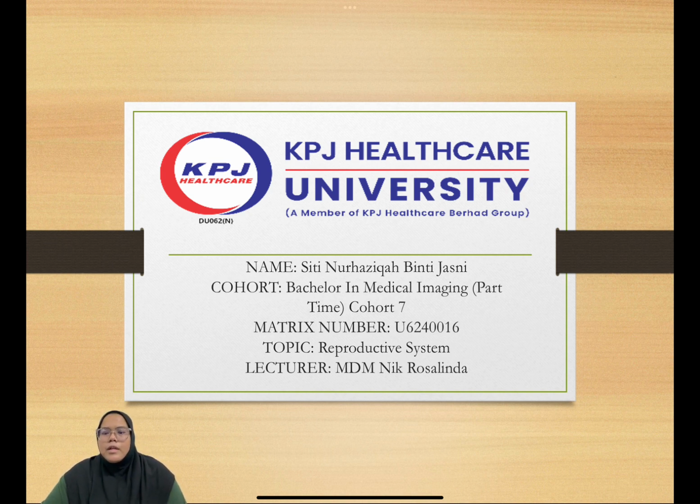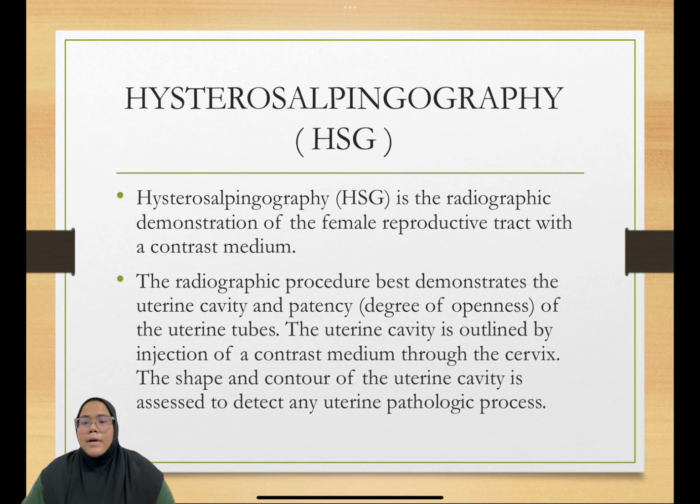Today I will present about hysterosalpingography, which is HSG. Okay, what is HSG? HSG is hysterosalpingography, the radiographic demonstration of the female reproductive tract with a contrast medium.